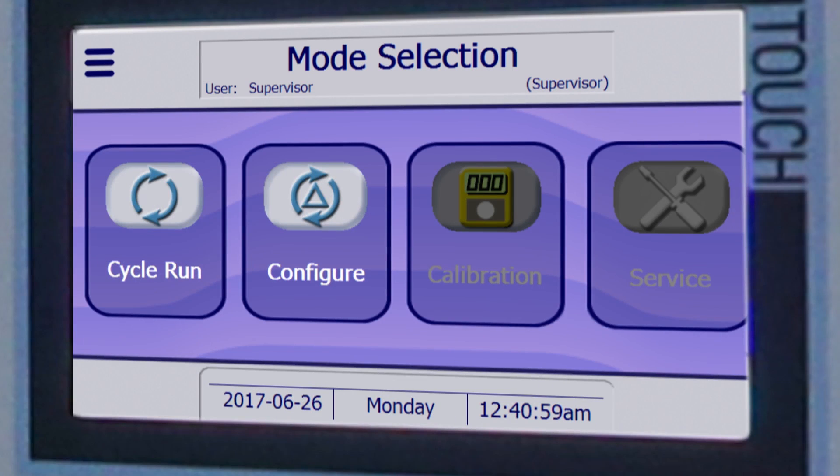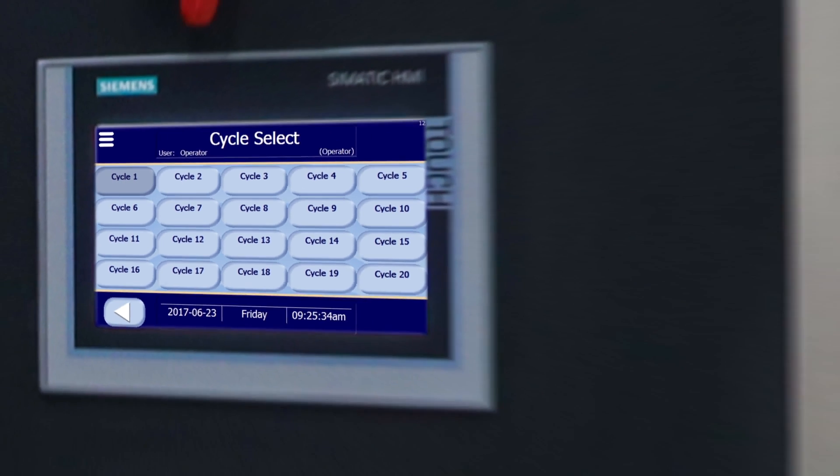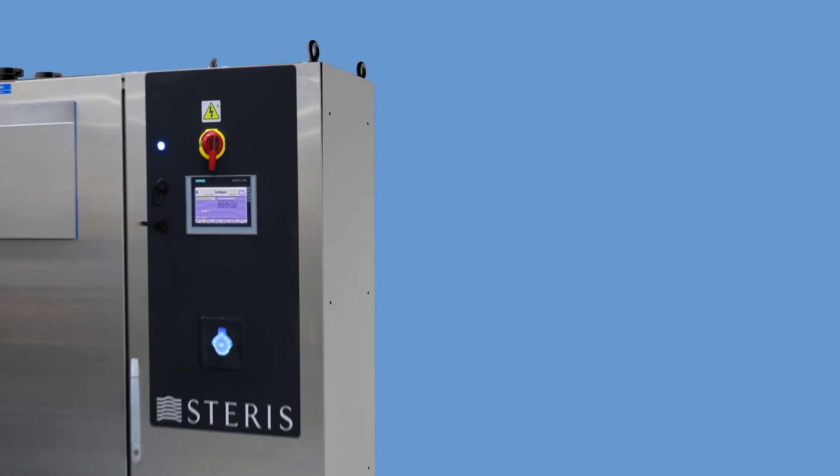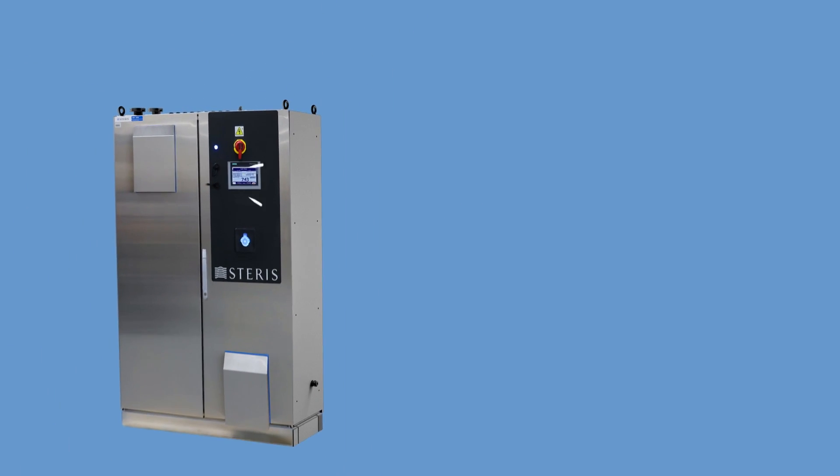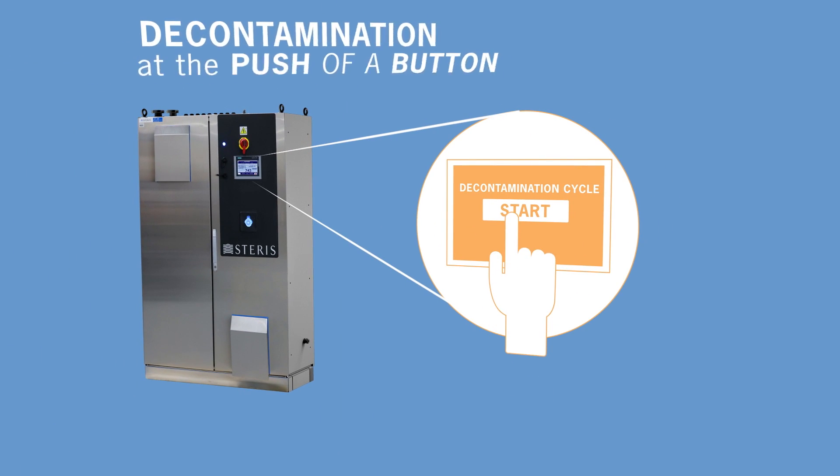Pre-programmed cycles ensure the repeatability of validated cycles for each unique area, making operations simple and reliable. At the push of a button, a complete six-log cycle is run.